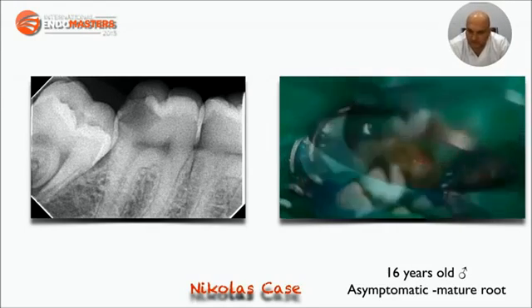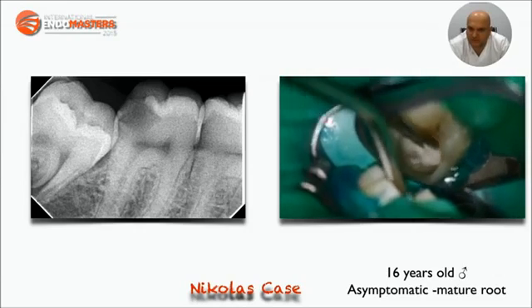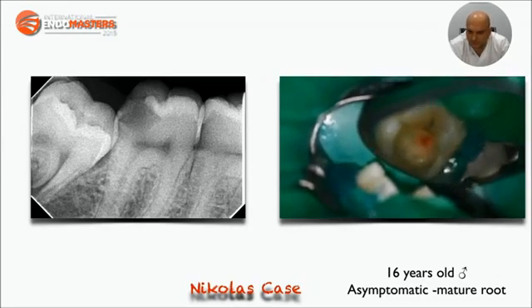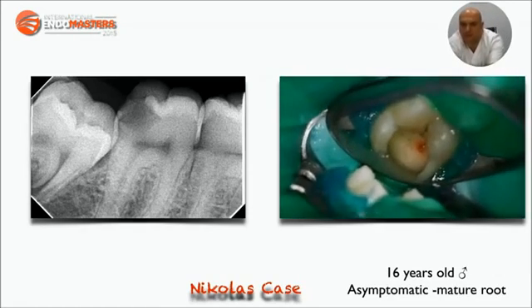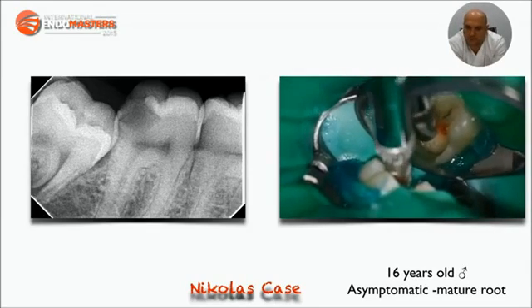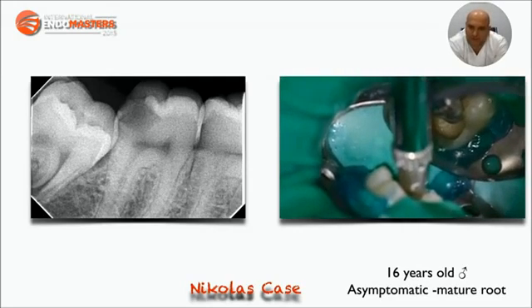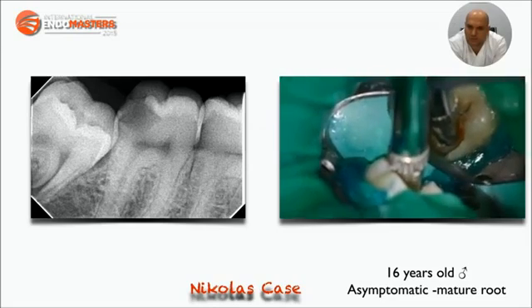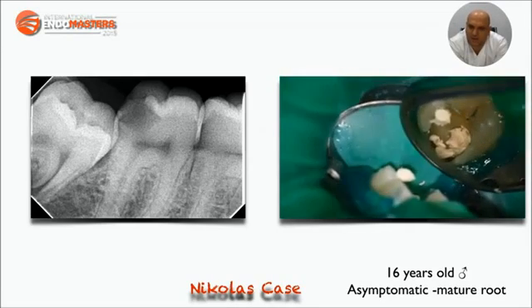You can see here the pulp exposure, pressure hemostasis with a sterile cotton pellet embedded with chlorhexidine, and Biodentine was placed over the pulp tissue exposure. The first shot of Biodentine is mixed with the blood, the second shot will be thicker, and the third shot would stay there.